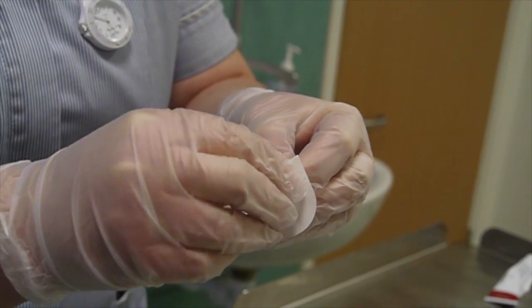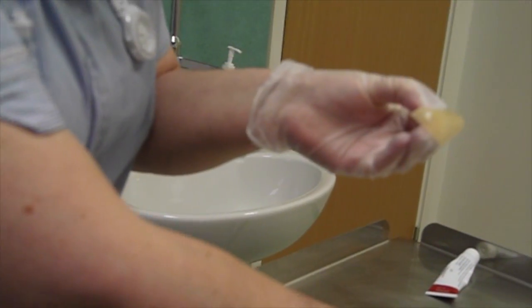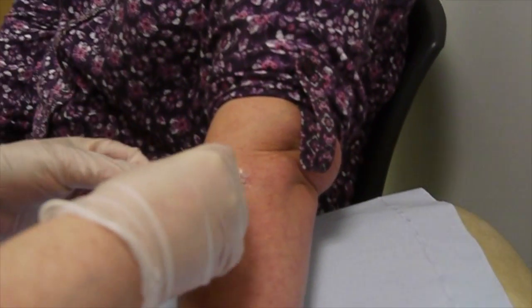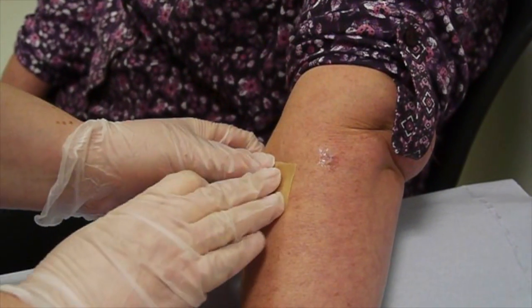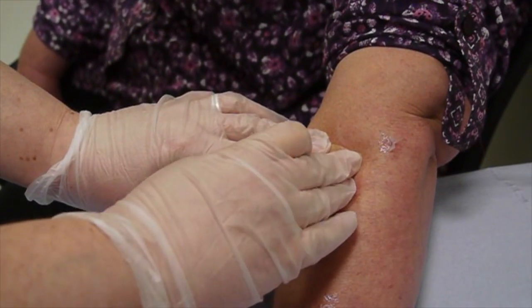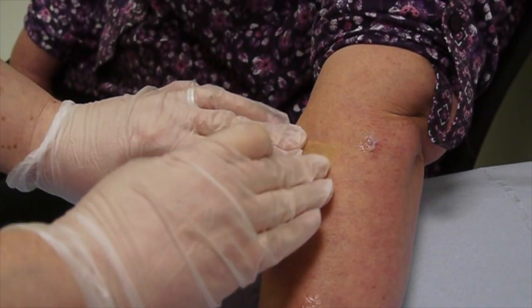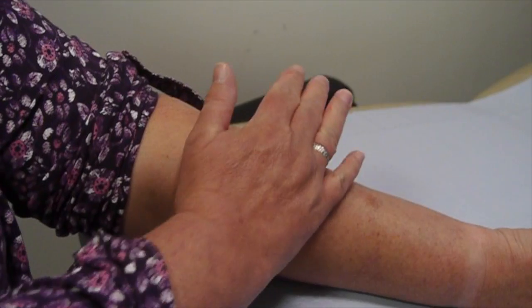The paper backing is taken off the back of the hydrocolloid dressing, revealing the adhesive side. Now the hydrocolloid is being applied over the patch of ointment over the eczema, and the nurse is going to ask the patient to apply her hand to warm it for 20 or 30 seconds, which helps it stick more effectively.